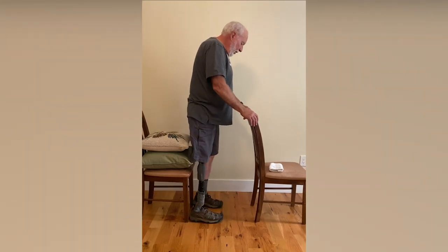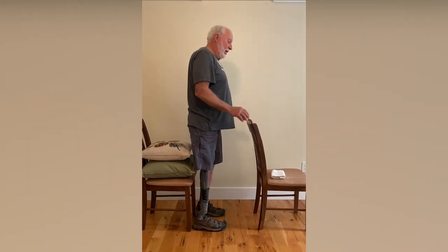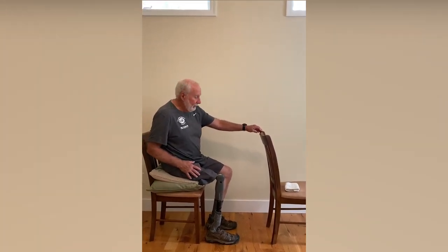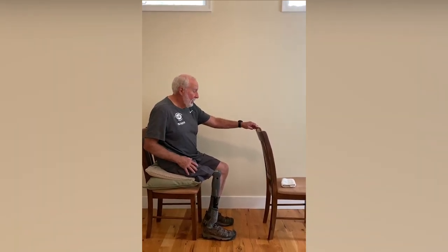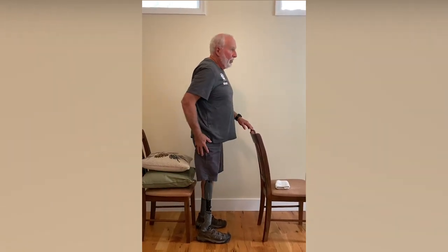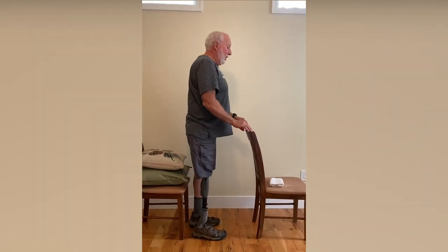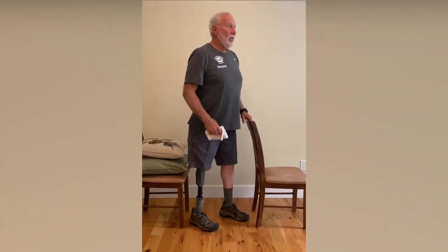So then you're going to put your feet slightly apart, and you're going to put equal weight on your sound side and your prosthetic side. And then you're going to sit down in your chair and use the muscles in your prosthetic side to help slow your descent. And when you get back up, you're going to consciously use the muscles inside your prosthetic to lift you back out of the chair, like this. Okay, so I'm pushing hard against my socket right now when I do that. So you can resist going down, and then you use those muscles to help you get back up. Some people may have a little bit of difficulty getting the knee to break properly because the ankle doesn't bend.